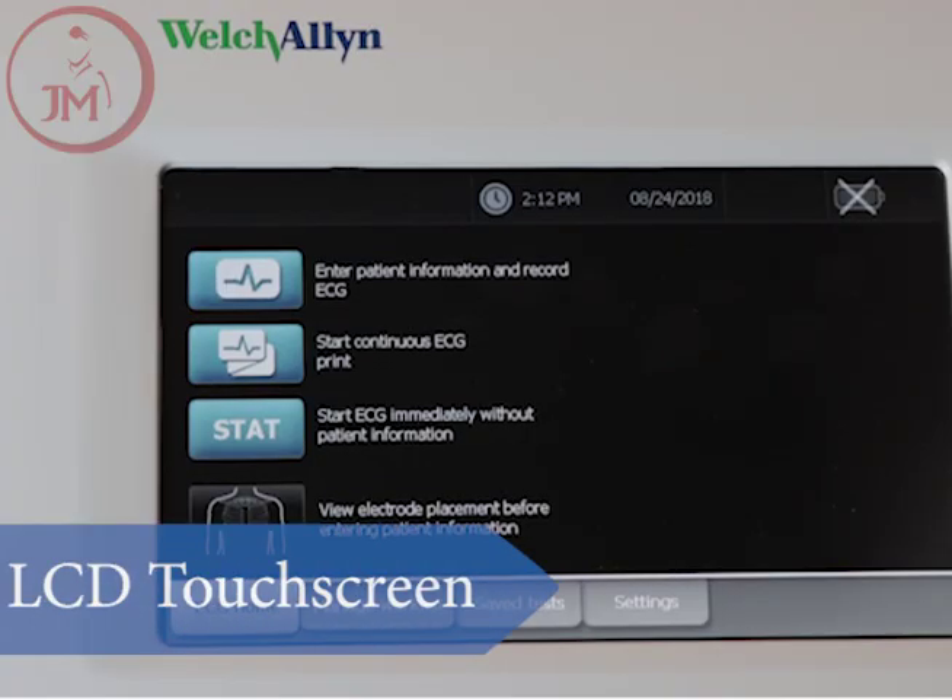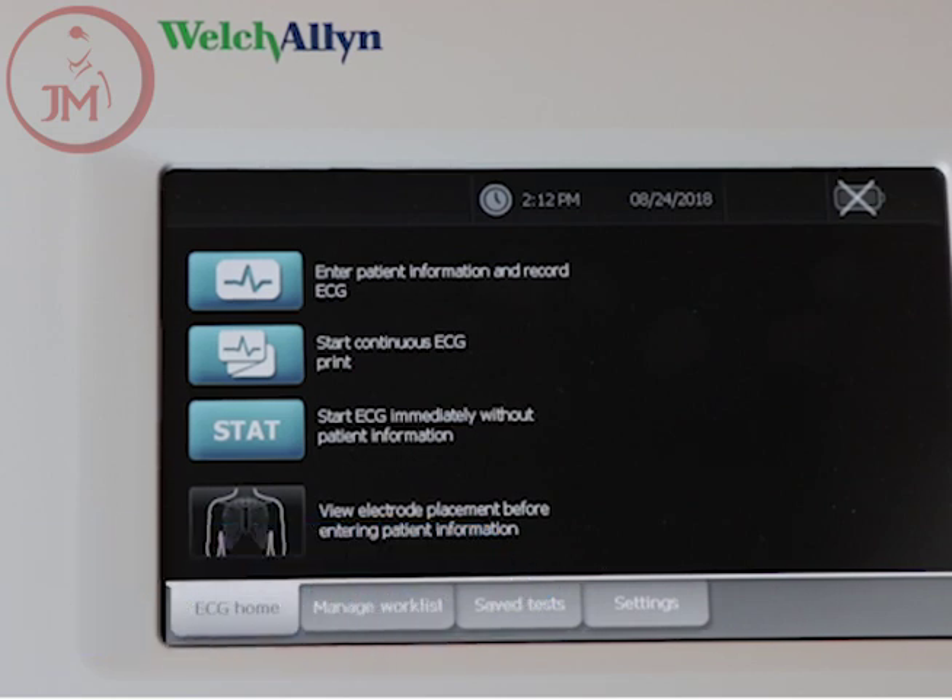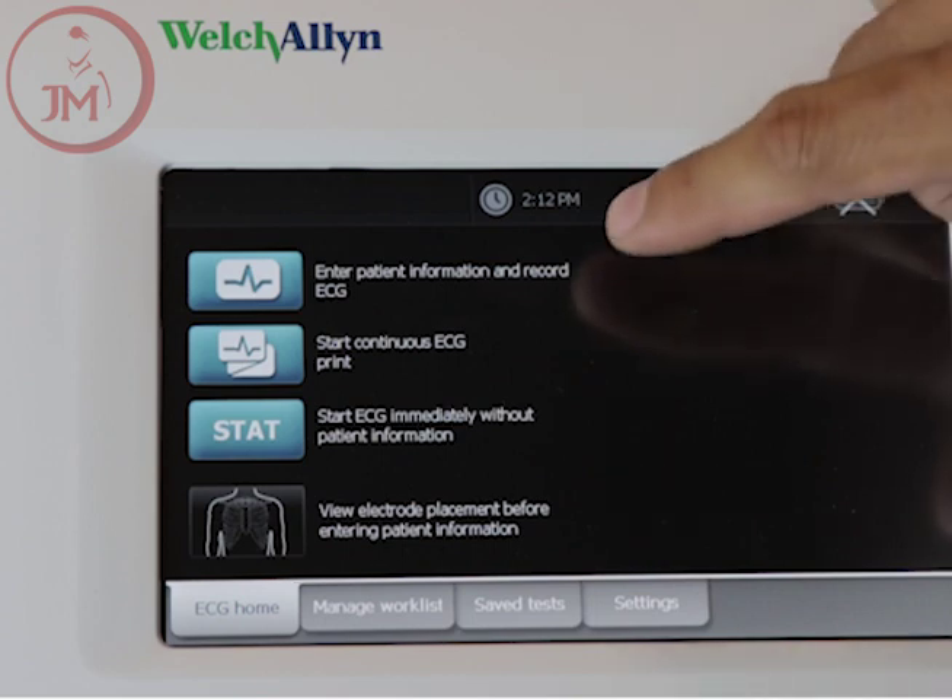One of the first things you'll notice about the Welch Allen CP150 EKG machine is that it does not have a keyboard. This unit comes standard with a 7-inch touchscreen LCD display.